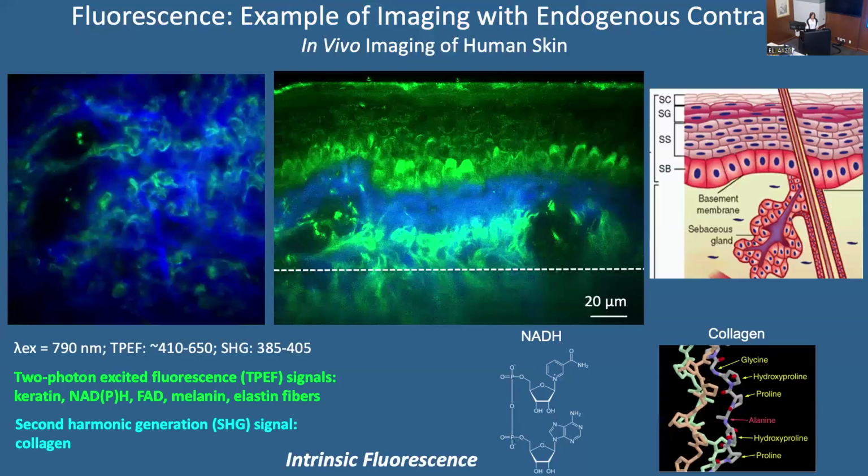So again, importantly, that's intrinsic fluorescence, intrinsic nonlinear signals that can allow us to actually use this method in vivo. We cannot stain or label or alter the DNA in our body. So these are the examples for using these different contrasts.